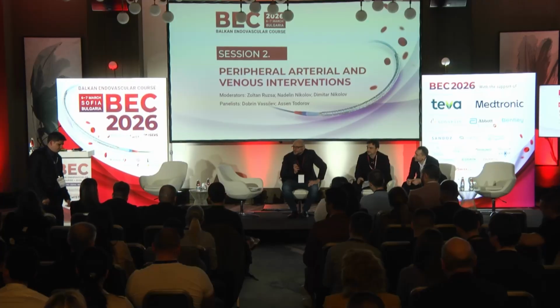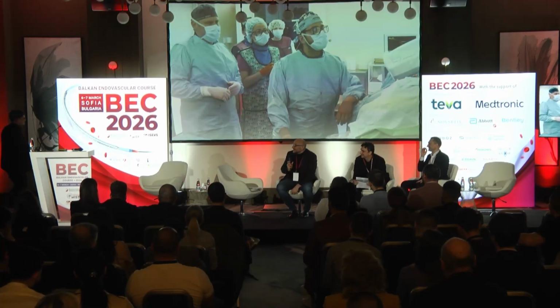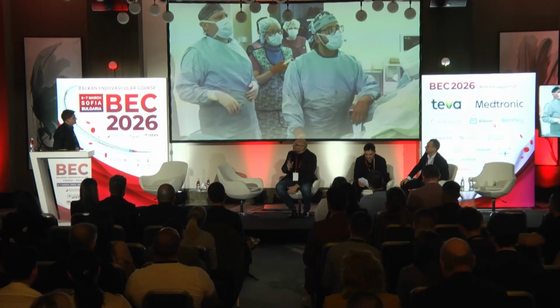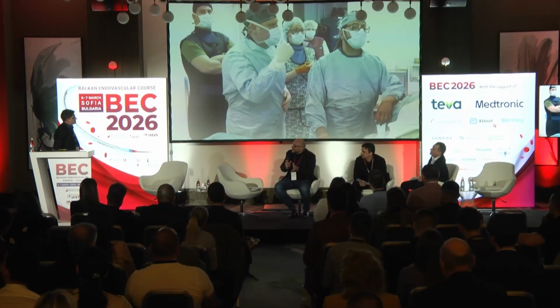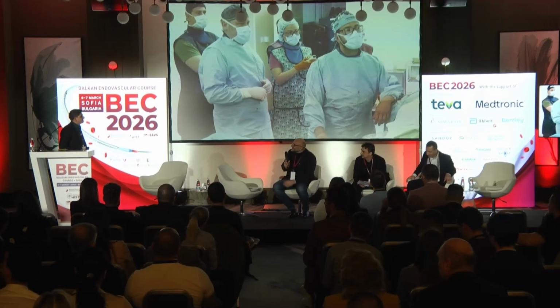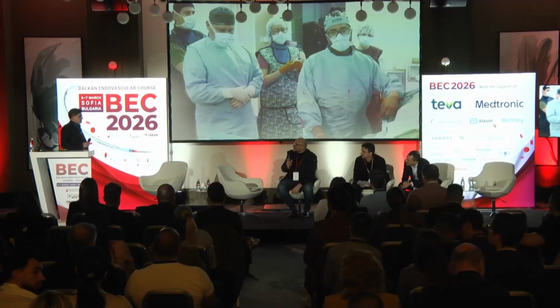Just one question to you, just for sport. It's a very interesting lecture, and congratulations, you started more than 10 years ago. Ten years ago you worked with the Wallstent. What has changed with the Wallstent? Now it is 2026, which stents do you use for iliacs and which stents do you use for vena cava?